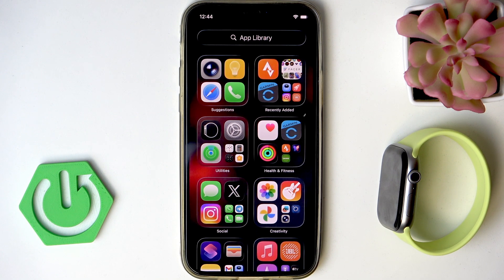Welcome! In this video I will show you how to take an ECG, or electrocardiogram test, on your Apple Watch Series 11.